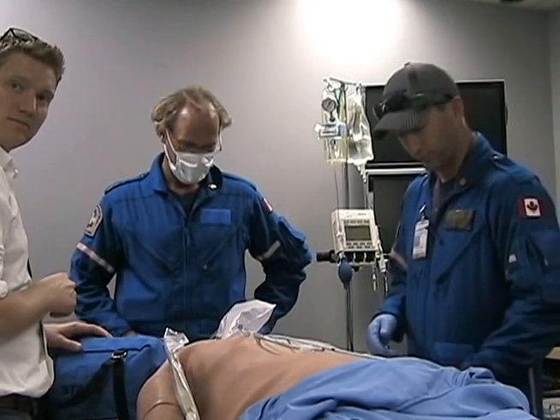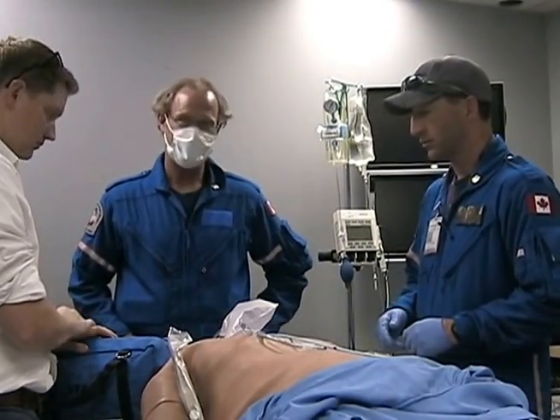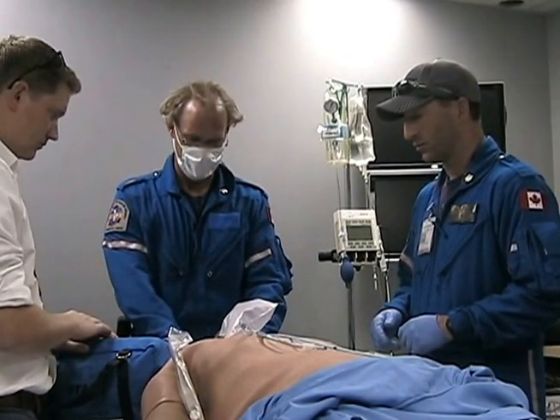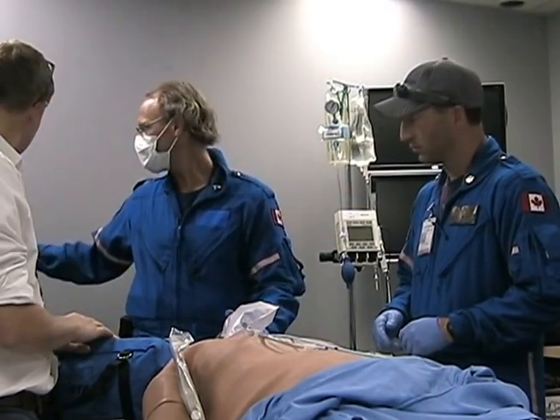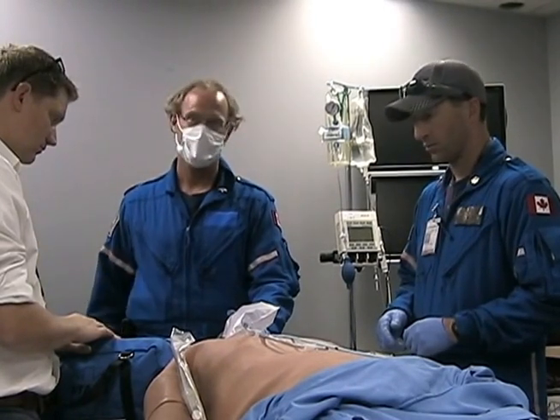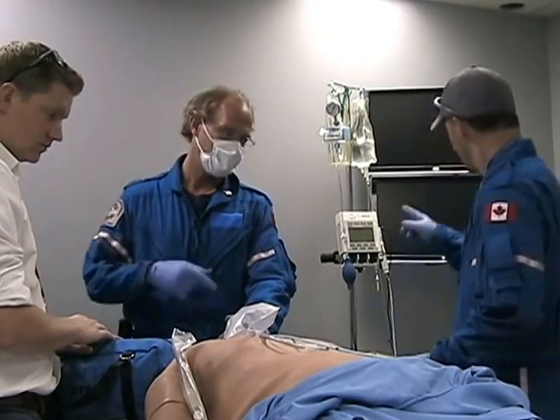Okay. There's provider 1, patient position optimized. It is optimized. Nasal prongs at 15 liters and NRB or BVM plus minus PEEP valve. Yeah, the NRB is there at 15 liters a minute. Okay. O2, 2 sources on, sufficient amount. They are correct. Monitor on. Monitor is on. Vital signs assessed. They have been assessed. Drugs, IV functional. It is functional.